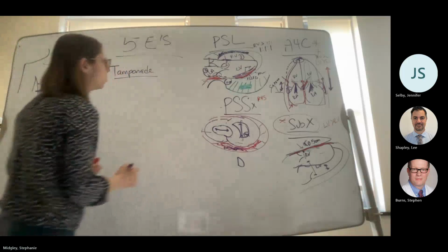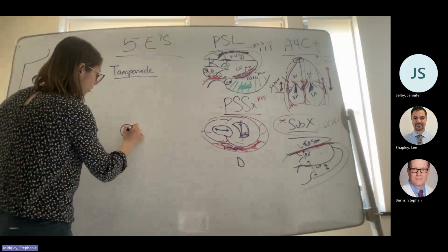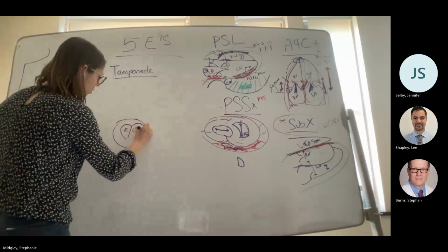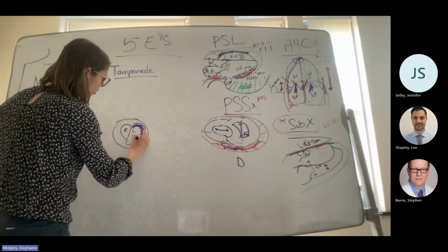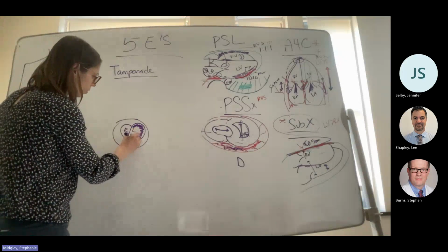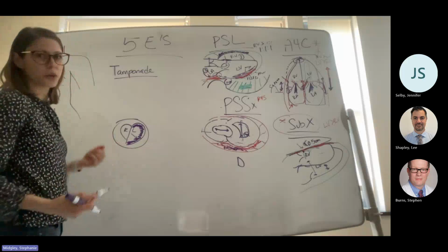So I'm trying to think which view. Okay, if we have our heart, here's my right side, here's my left side, here's my fluid. My left side is much stronger than my right side. My right side is my little puny guy. When my left ventricle fills and expands, that fluid has to go somewhere.